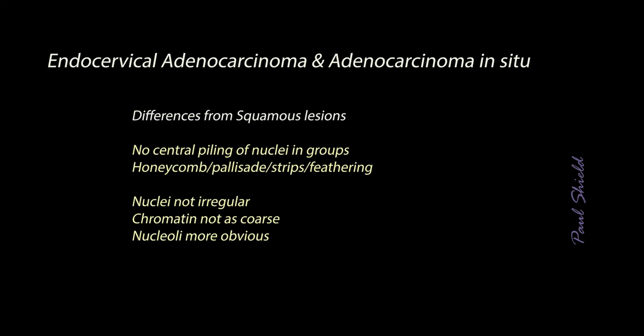There's a number of benign conditions that can mimic high-grade glandular neoplasia and invasive cancer, but we're not going to go into those today. More common is something squamous or is it glandular? It's easy to work out it's high-grade, but harder to work out the differentiation. And the key clues to that really are looking for architectural clues.